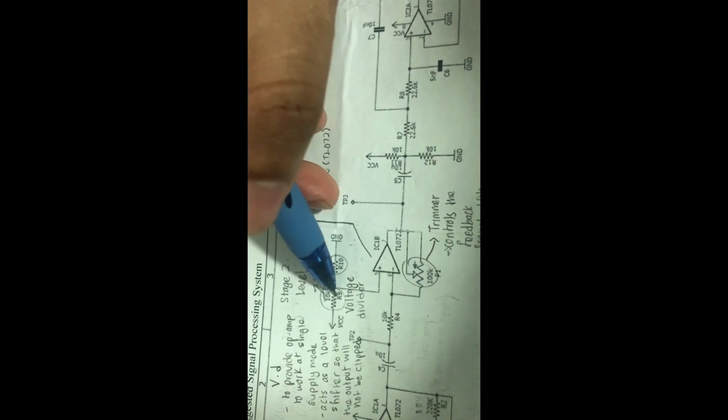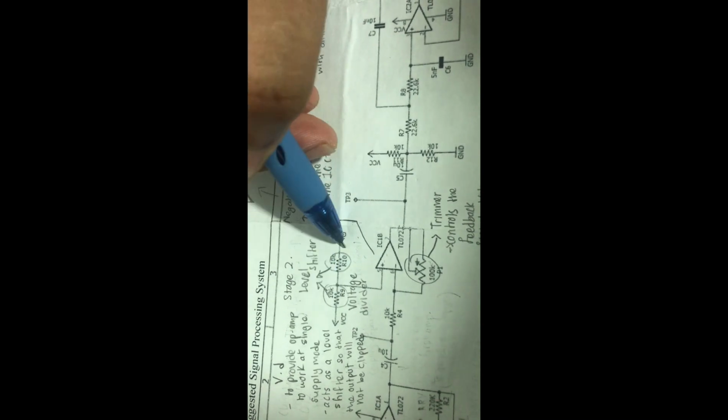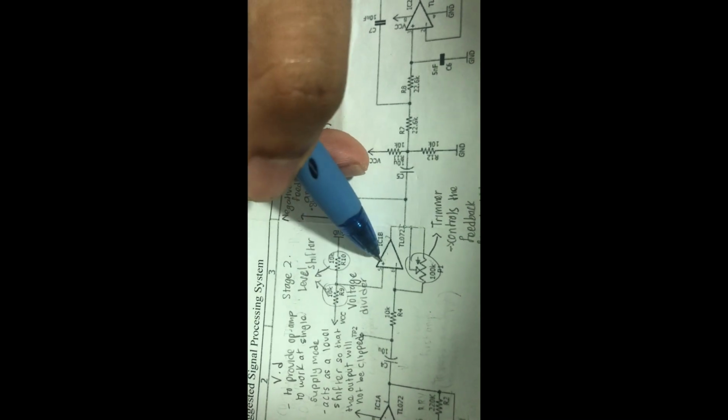So this trimmer here can reduce the overall gain of the amplifier and also will function as a linear amplifier. Okay, now here we have a voltage divider as well. It is made out of two 10k resistors, R9 and R10, which is connected to R5.